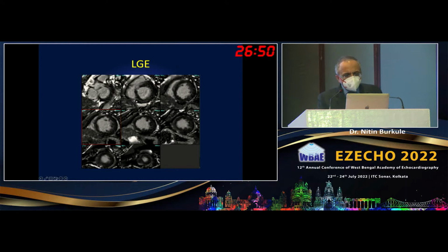So from this I know there is a good dysynchrony between septum and lateral wall from feature tracking. I know that there is hardly any replacement fibrosis. This patient is going to have excellent prognosis after AVR and a CRT. So this information is very confidently I can give you over and above my resting echo image. And secondly, also I could get a very good planimetry and know that this is a bicuspid aortic valve and give a very good planimetry, which was technically difficult on the echo.